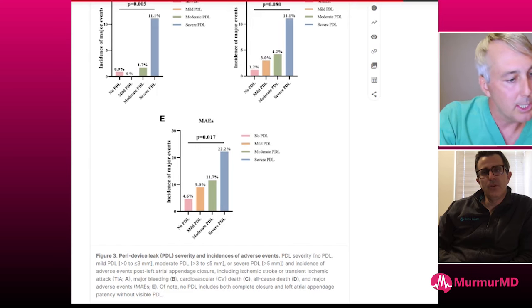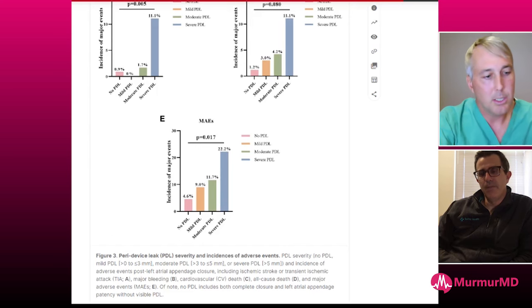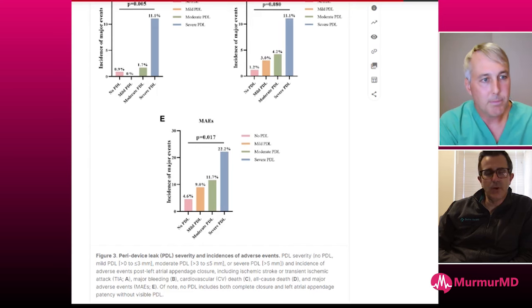So you're doing these CTs. At what point do you have a different protocol for, say, someone who's in permanent AFib or long-standing persistent AFib versus paroxysmal and is mostly in sinus, or do you have a standardized protocol for 6 weeks of anticoagulation or 6 months of DAPT, and then we image? What's your general protocol?